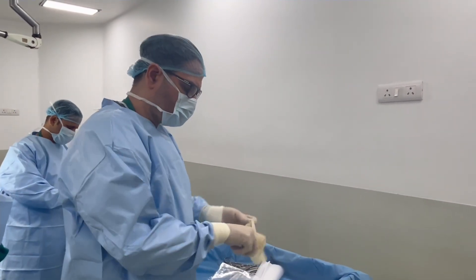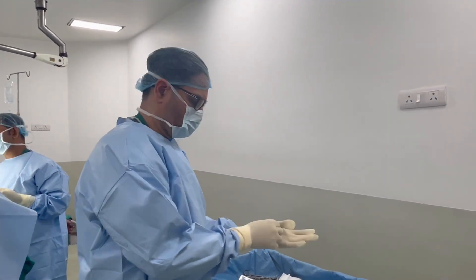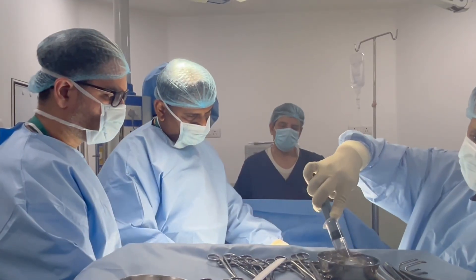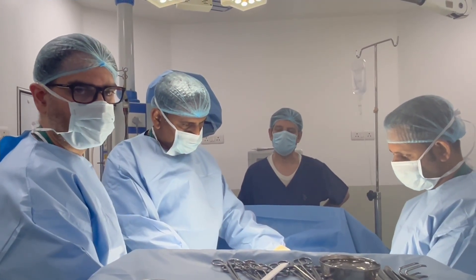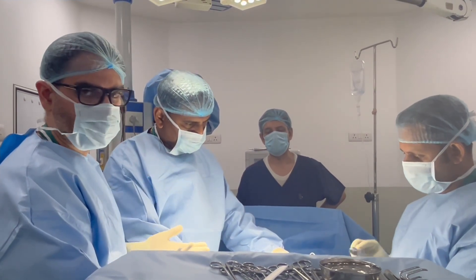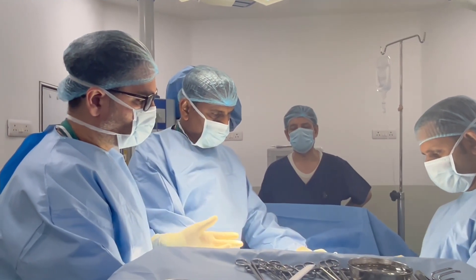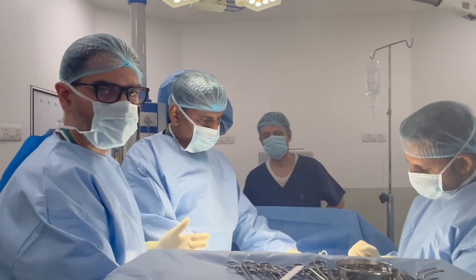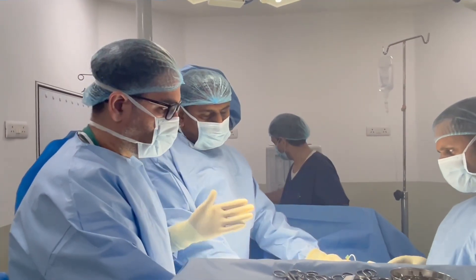We always have double gloves at the time of surgery. First of all, let's start artificial erection. We put a butterfly needle in the corpora and inflate with saline. From the artificial erection, it comes to the exact penis size — there is no curvature, no deformity. It goes to the exact shape and size, the full length, and we can apply the maximum size implant.